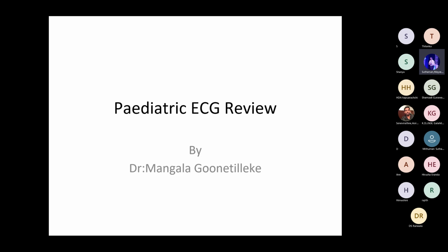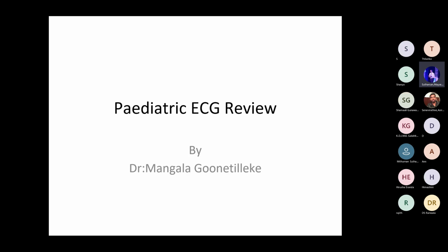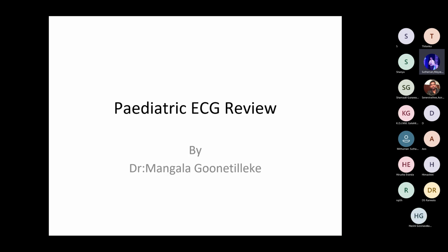Okay. So the format today is I'm not going to deliver a lecture on the pediatric ECGs, right? So this is a question and answer. So it will be an interactive session. So I'll throw the questions and you all should answer, right? But I'll give a history and then I'll show the ECG, because without a history, you can't just read an ECG. If somebody gives you an ECG without a history, don't read. Because you don't know what's going on, especially in children. You need the age, because pediatric ECG is age specific, right? Okay. So shall we start? Let's start. So take the challenge, right?